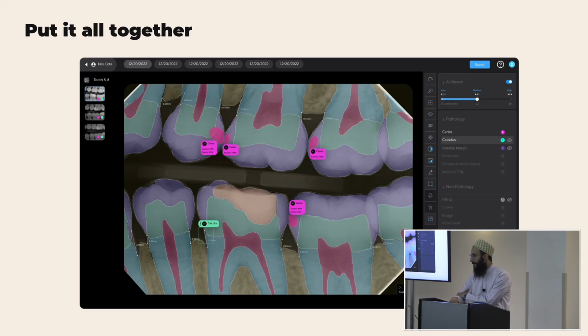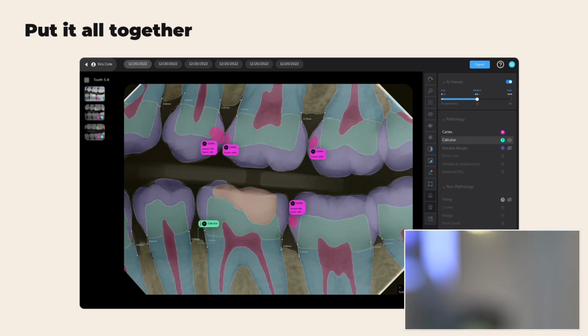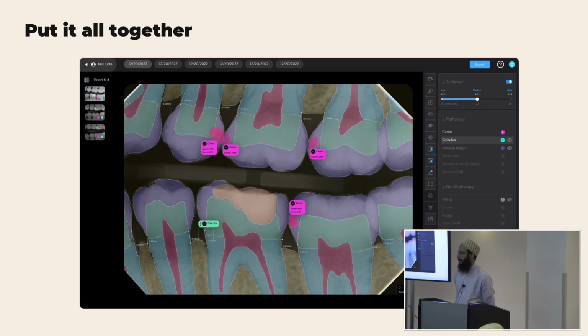One other thing that I think Hamza didn't mention, and I don't know how useful this is in caries control, but one feature I really liked is that it also gives us a percentage penetration into enamel and into dentin. Sometimes if you see enamel limited lesions and are unsure whether they're into the dentin or not visually, Pearl, the second opinion, gives you a little bit of an insight on what it believes is penetrating into dentin or not. And so sometimes it says 100% penetration into enamel and dentin, and you can decide whether to treat or not treat those.